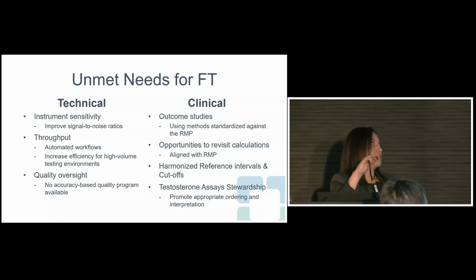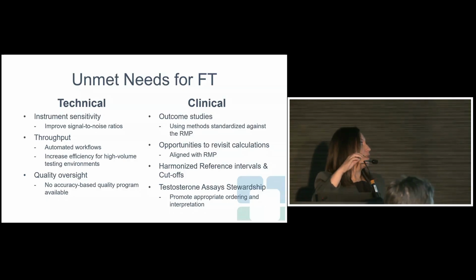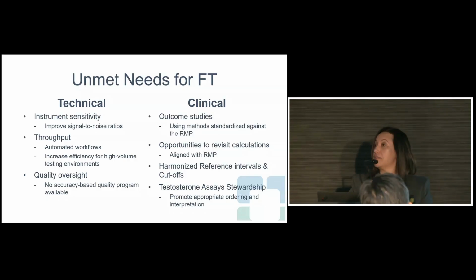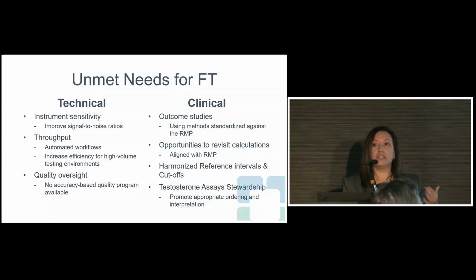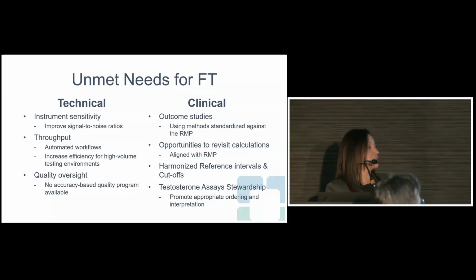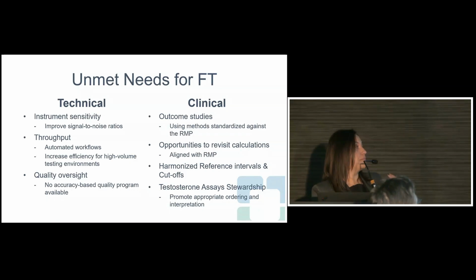This is really our last slide, where we're highlighting, number one, that we have the win, we did it, right? So we developed that method that we could use the same principles of the total testo assay to measure free testo assay with our instrument, with our manual capabilities, but there are vulnerabilities that we have intrinsic to us, our volumes, and also intrinsic to the concern about losing signal, etc. So the need for perhaps becoming more robust in the future.